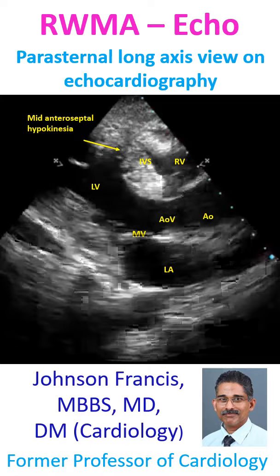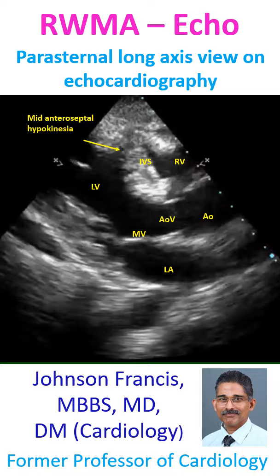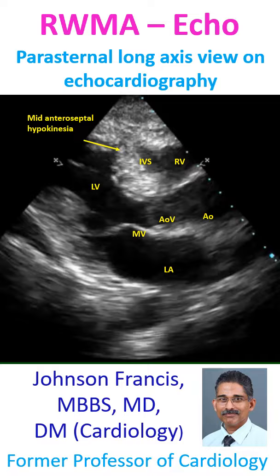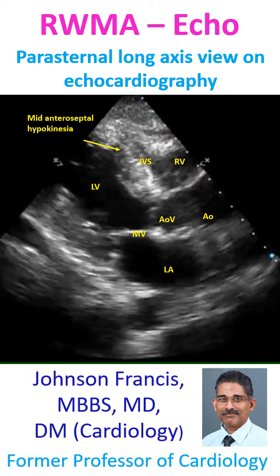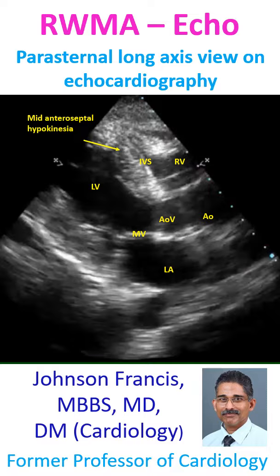This is the parasternal long axis view, known in short as PLAX view on echocardiography. Usually this view is obtained first during adult echocardiography. It shows portions of the right ventricle, left ventricle, aorta, and left atrium. The interventricular septum is seen between the two ventricles. Aortic and mitral valve motions are also visible.